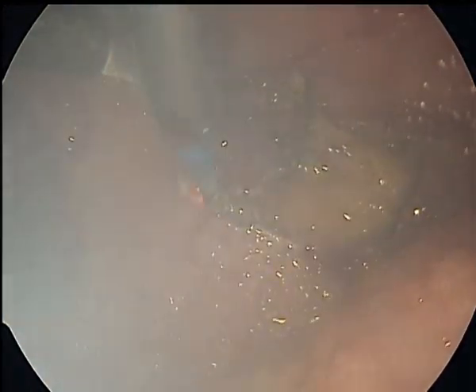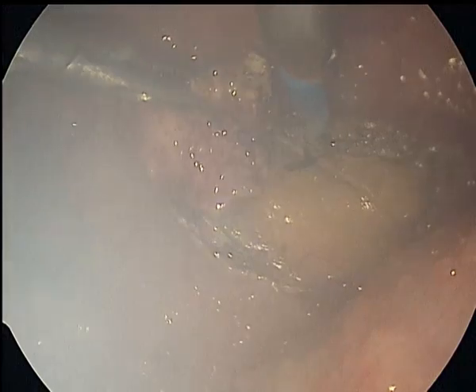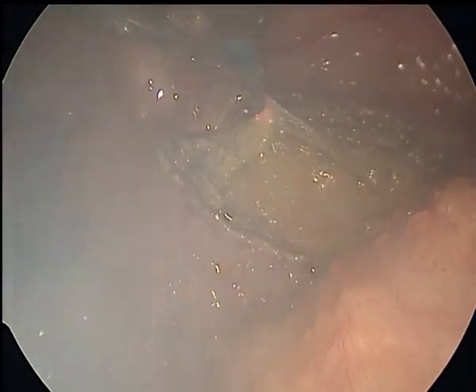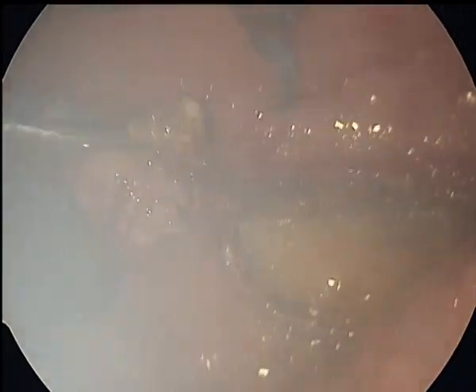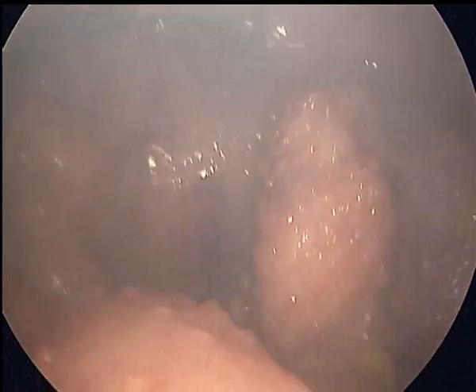So here you can clearly see this is a large chunk of tissue, so that will be very good for the tissue diagnosis. This is the last part where we are separating the peritoneum from the underlying structures. And once this is done, we put the specimen on top of the uterus. Here we can see that we are putting that on top of the uterus.